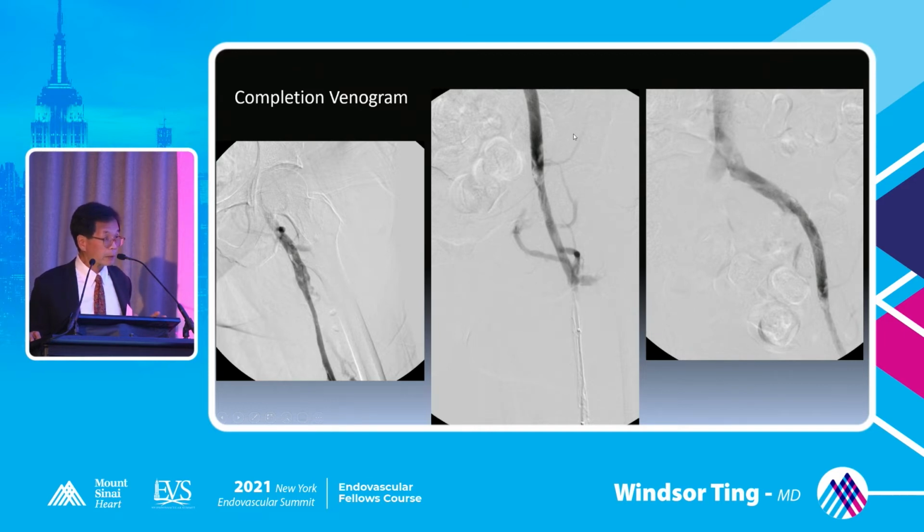It's not perfect. I can tell not all the thrombus was removed, but the common femoral vein was patent, and so were the external and common iliac veins in this case. So, a relatively good outcome. And I think this patient will do well, and this patient, in fact, did really well.